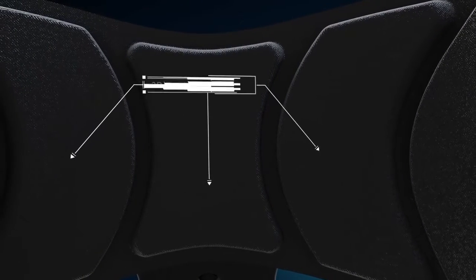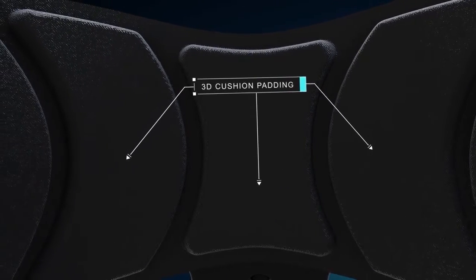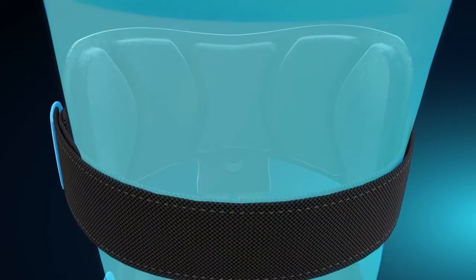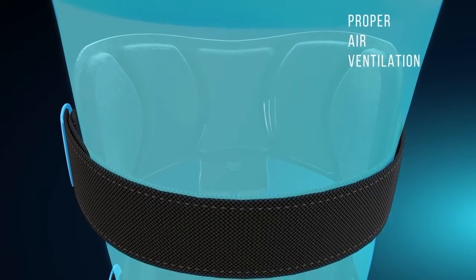On the inside of the polymer cuff, there are 3D cushioned pads that not only ensure a comfortable fit on the arm of the patient, but also allow the required amount of ventilation through the runnels.